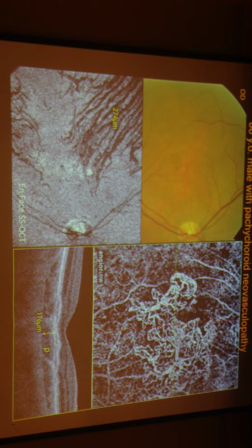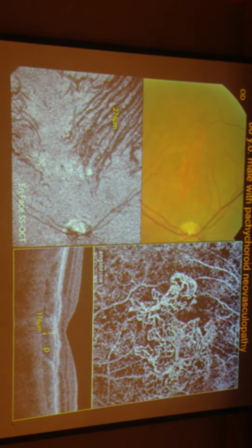Claudine, I have a question. Is there any theory as to why some focal vessels may be dilated? That's the first question. And secondly, when you define pachychoroid, is it just based on diameter, or are there other features? Yeah, right now there is no set criteria or set number for what is pachychoroid.